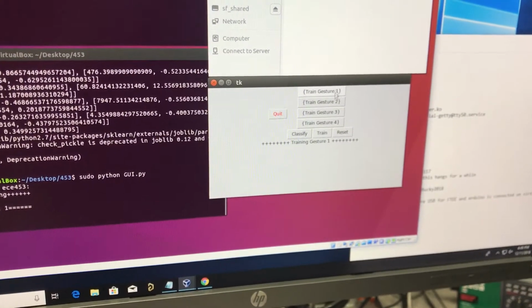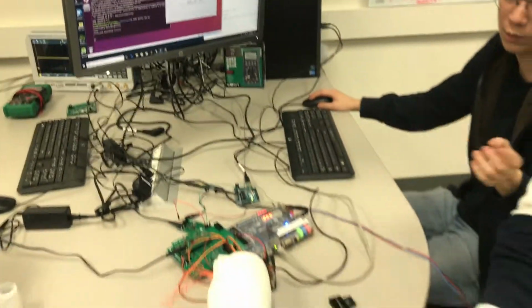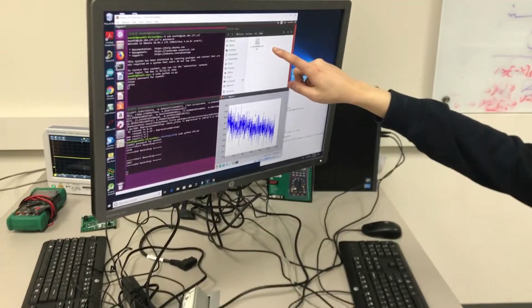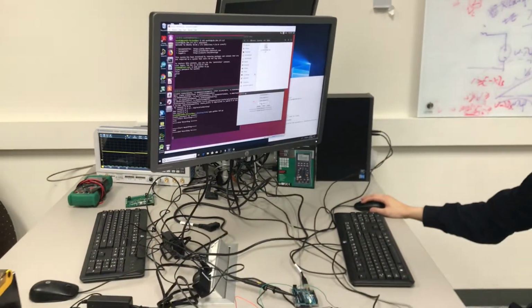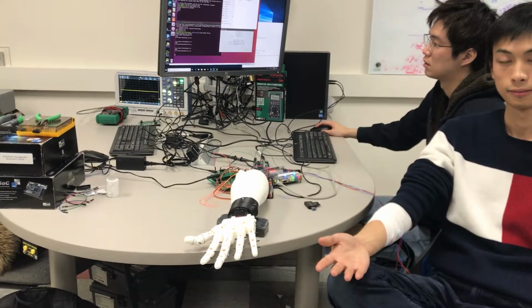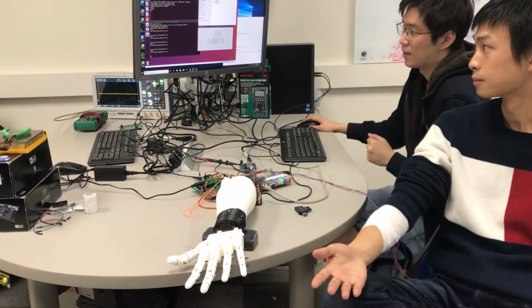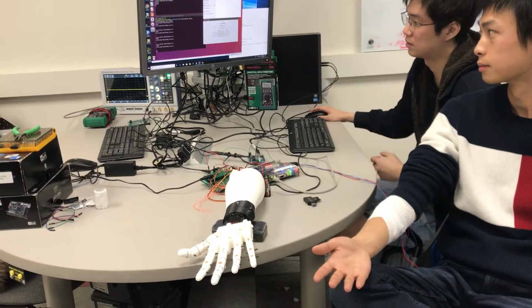And then every time I click this button, it's going to train the gesture and then output a graph. So right now we're going to train gesture number 4, which is the still hand. And then as you can see, it outputted the data in a CSV file format, and then it outputted the plot as well. And then we're going to train this 2 more times. And next we're going to train gesture number 1, which is going to be a holding motion. And as we previously trained gesture 4, we're going to train it the same way 3 times.